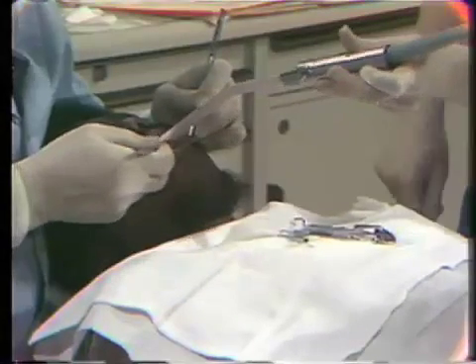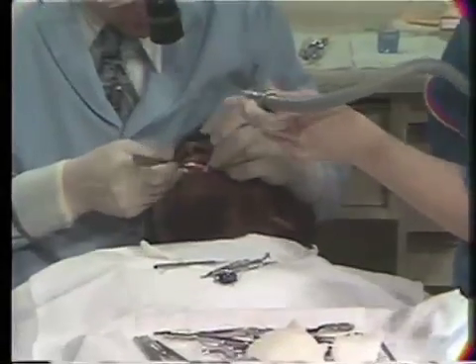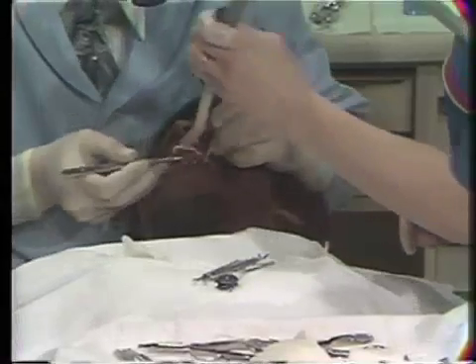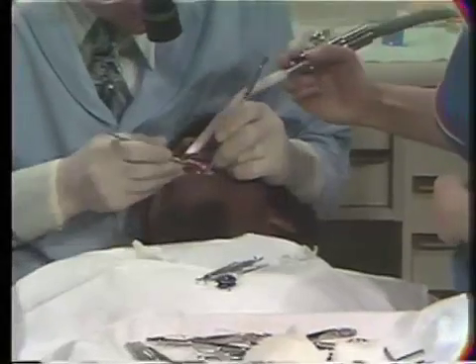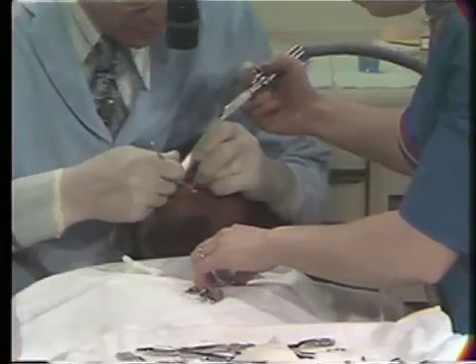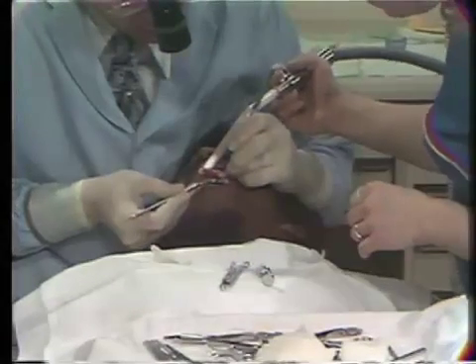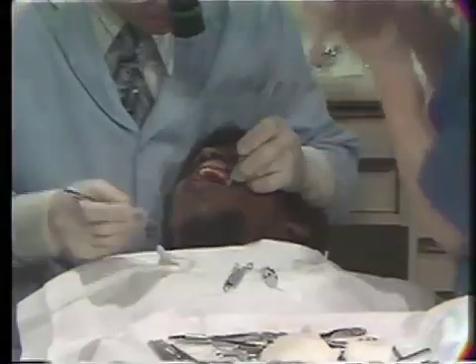You can notice underneath my right hand is a sponge on the patient's chest. And if I use that sponge and get it too filled with red material or saliva, she'll get it out of the operating area and replace it with another one. One factor that is quite important during periodontal surgery is, once you start, get in, get it done, and get out. And this is where an assistant is extremely valuable. Inside.